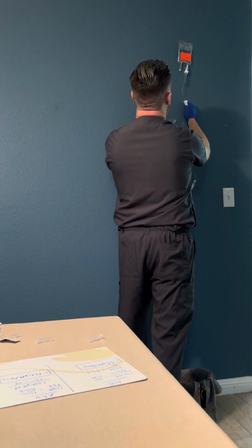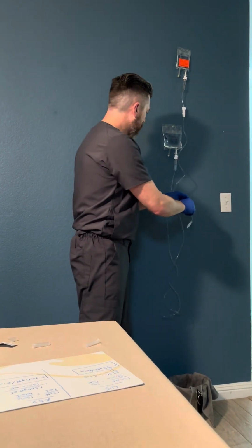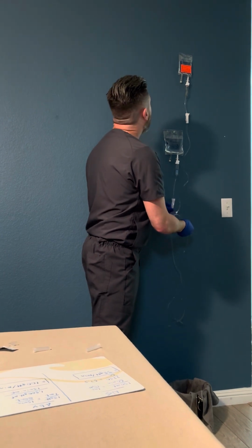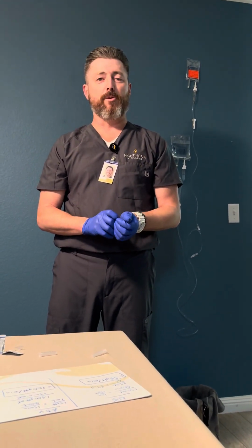And good. Timing's good. That's 100 drops per minute. And we would cap the end. And we would clean up our mess, do a hand hygiene, document what we've done, and voila, we've done IV and medication and fluid administration.